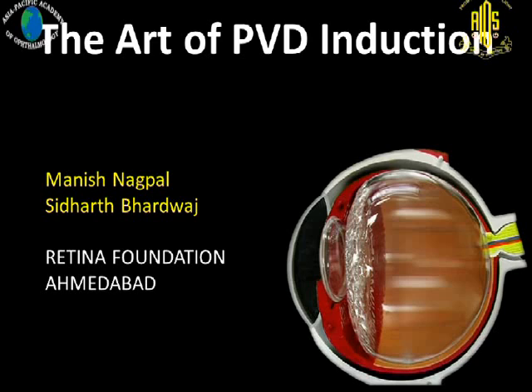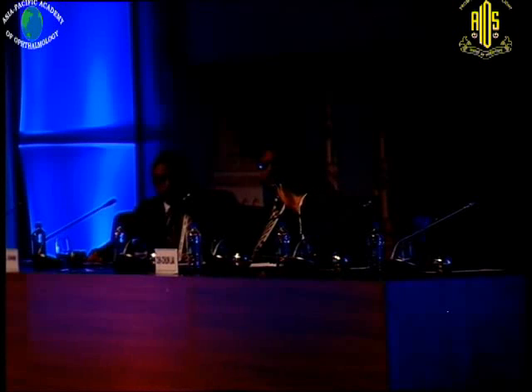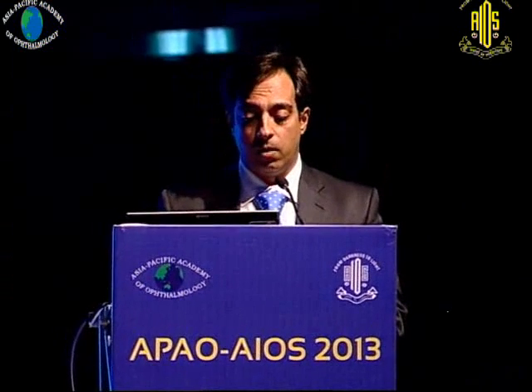I would be talking to you about the art of PVD induction, which has become an integral part of any vitrectomy procedure nowadays, and for different conditions there are different variations on how we approach it and do this part. We all know that the vitreous is attached very comfortably all around at 4 or 5 different places, and then there are pathologic attachments as well which come into play, and then we need to take care of all those areas while we are doing this procedure.